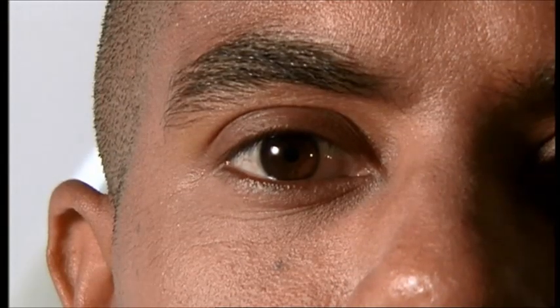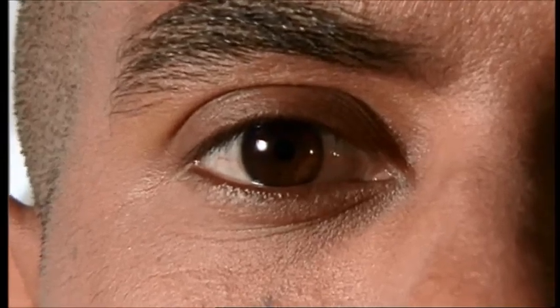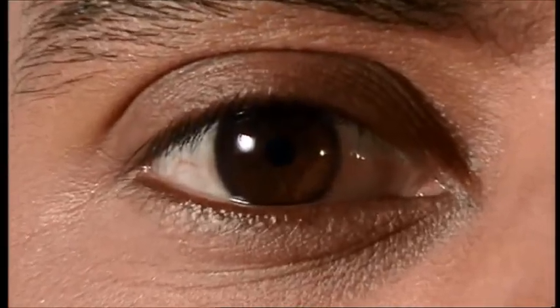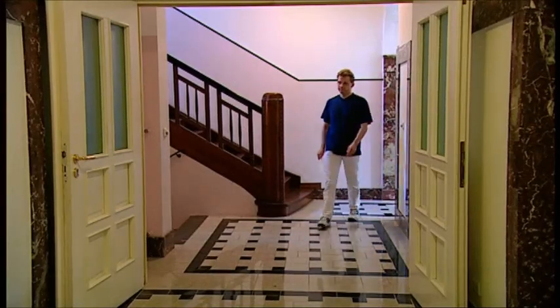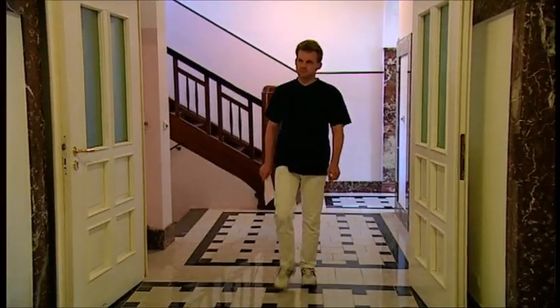There is also a risk in scanning patients who may have embedded metal fragments in or near the eye. Machine tool operators, metal workers, and welders should be given an X-ray examination to detect the presence of any metal particles.